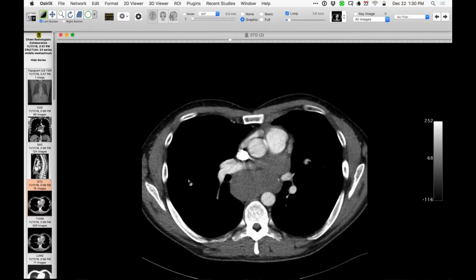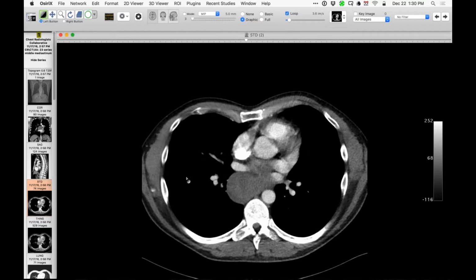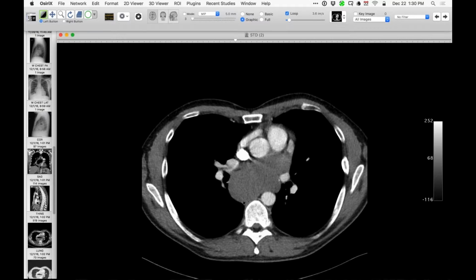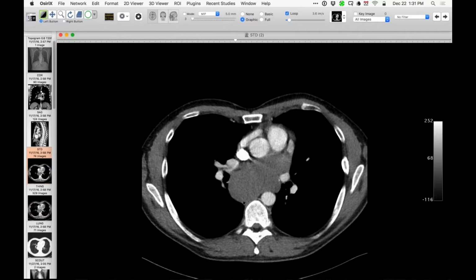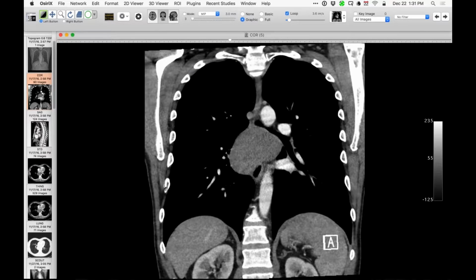I know that we have another case here in which Lev did some MR, and I'll try to get him to show the cases. He also did some additional VIBE sequences after gadolinium and showed some features consistent with a cystic lesion rather than a lymph node. A different case from this, but in terms of problem solving, MRI can be really great at solving the issue. Is this really a cystic thing or not? We've done it on a couple where, like you said, it was higher attenuation, but in the right location, fairly homogeneous, well circumscribed, clearly has a high potential to be a cystic mass. I think the problem with ultrasound is if it's complicated or complex, they may have a harder time with it. And that way, if it's cystic, the surgeon just goes in and takes it out as a bronchogenic cyst.